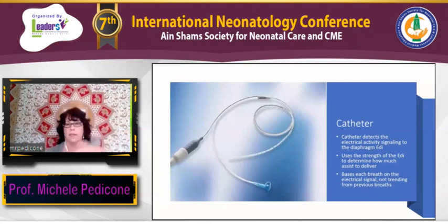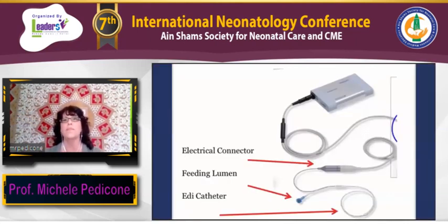The other end of the catheter has this cable, which will connect into, I think I have a photo here. There we go. It will connect into the cable that goes to the module, which goes into the ventilator. So it's a very handy piece of equipment. It comes in 3 sizes. This is a 6 French for our babies that are less than 1 kilo.